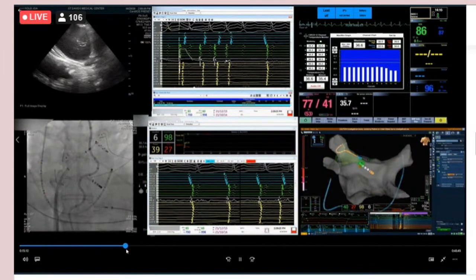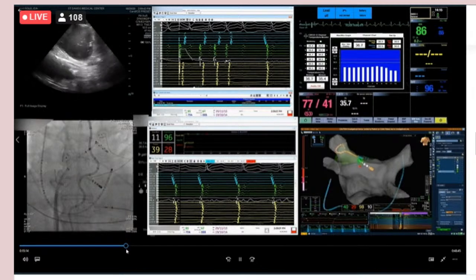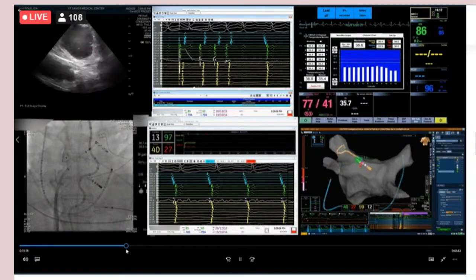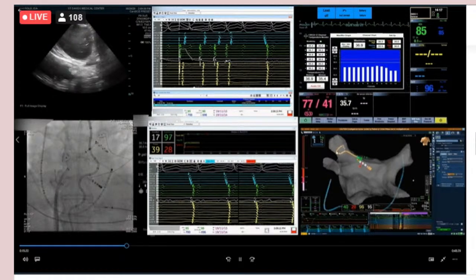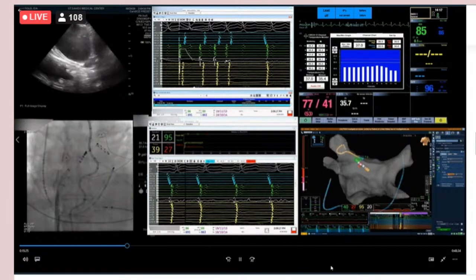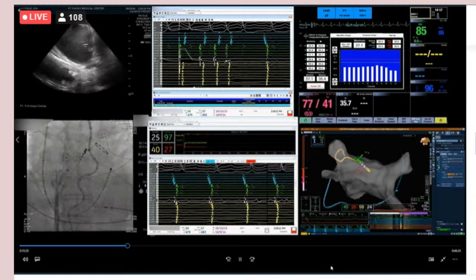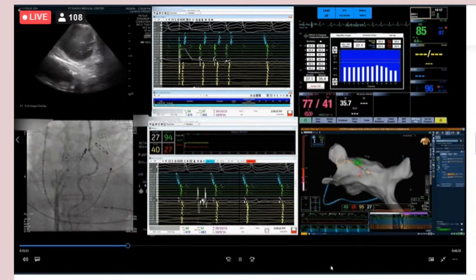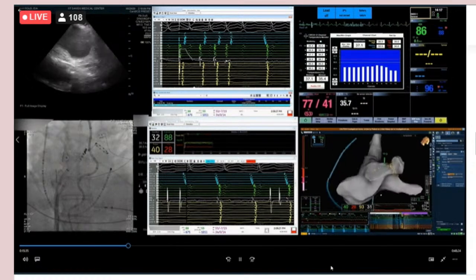Okay, here we go. And so the catheter actually performs pretty well. We've actually been pretty happy. Yeah, there is an arrow there, and you can see I really like the arrow, in particular as you start to move towards the roof and start to move anteriorly, it sort of helps guide you to make sure that you're able to slide along that and make sure you're not in the appendage, that your arrow is pointing away from the vein as you go more anterior.